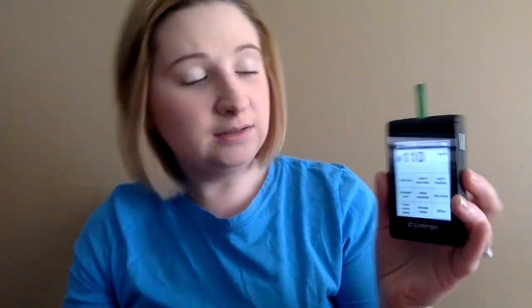It says insulin and carbs. Next, select the option that best represents how you're feeling. Tracking this helps determine patterns that can make diabetes management more effective. Okay. I feel fine, I'm stressed out, I don't feel well, after exercise, missed meds, took more meds, ate more, other, or lightheaded. I feel fine.